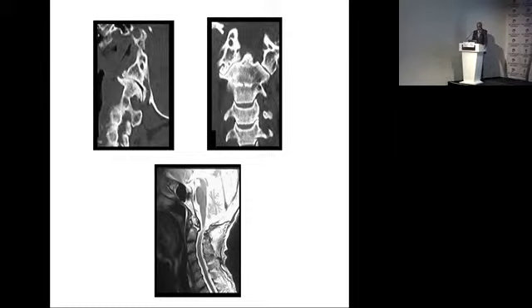So you see here, this is a degeneration of the craniovertebral junction. The joint spaces are reduced. There is osteophyte formation here and here. And in the midline, there is ligamentous buckling. And this ligamentous buckling is the initiator of osteophyte formation. You agree? You agree?